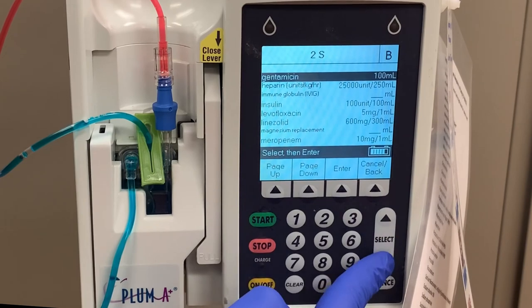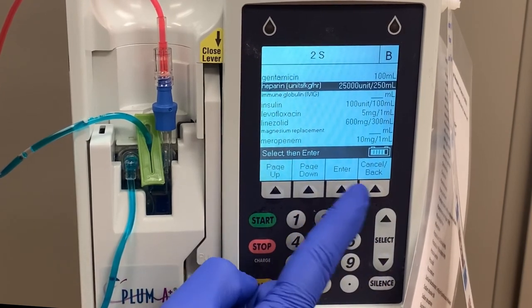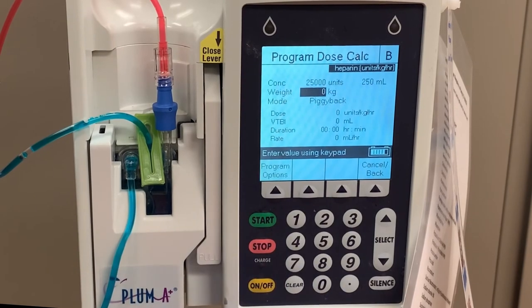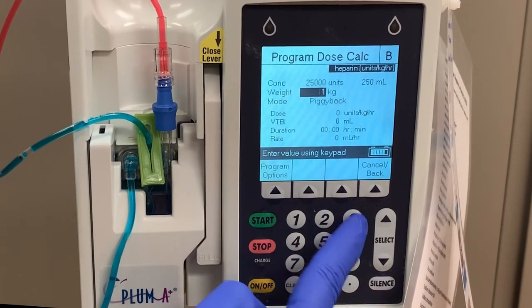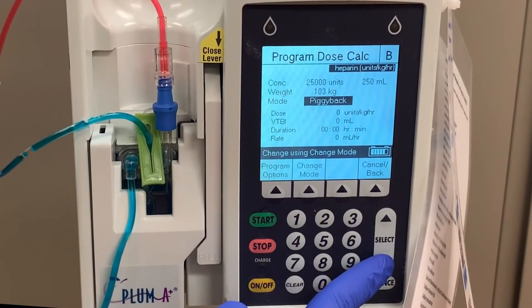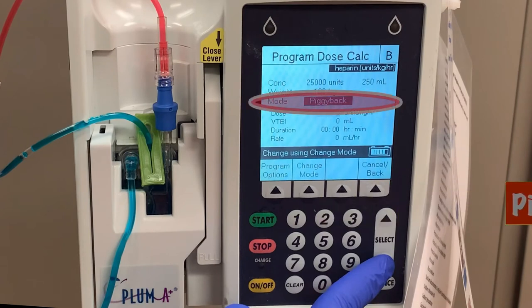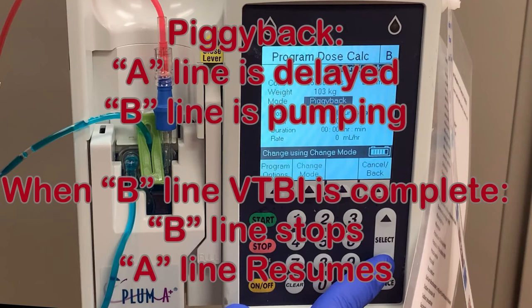Just like when programming the primary line, you'll need to utilize the drug library to choose your medication. We'll use heparin as the example. Choose standard program, and all of the programming features are the same as with a primary line, except for one additional category, which is mode. The default mode is set to piggyback. When running in piggyback mode, the A line is delayed while the B line continues to pump. The B line pumps until the volume is completed, in which case the B line stops and the A line resumes pumping.